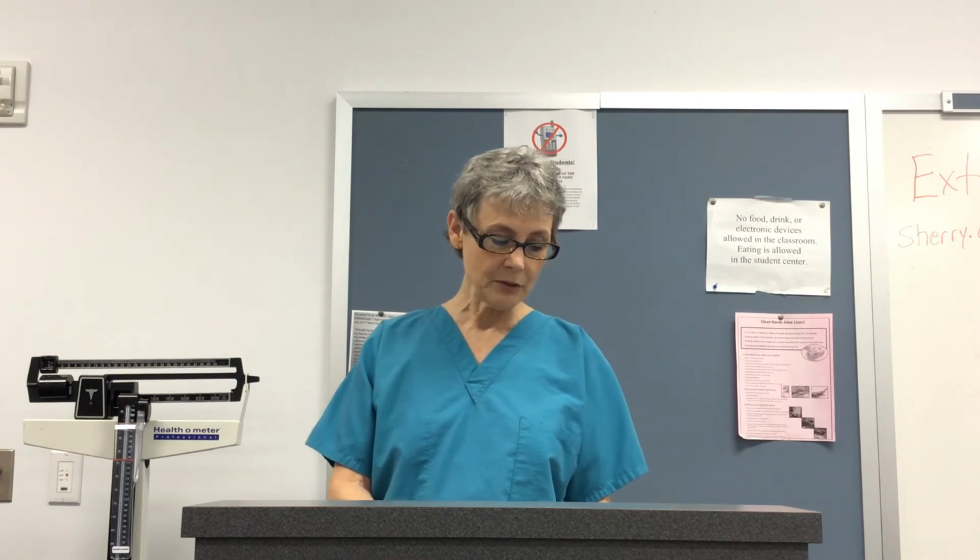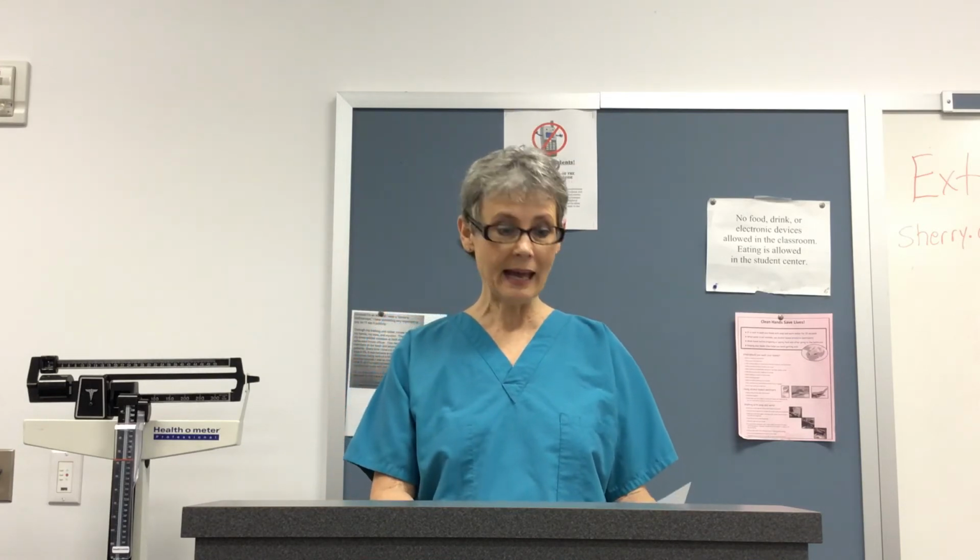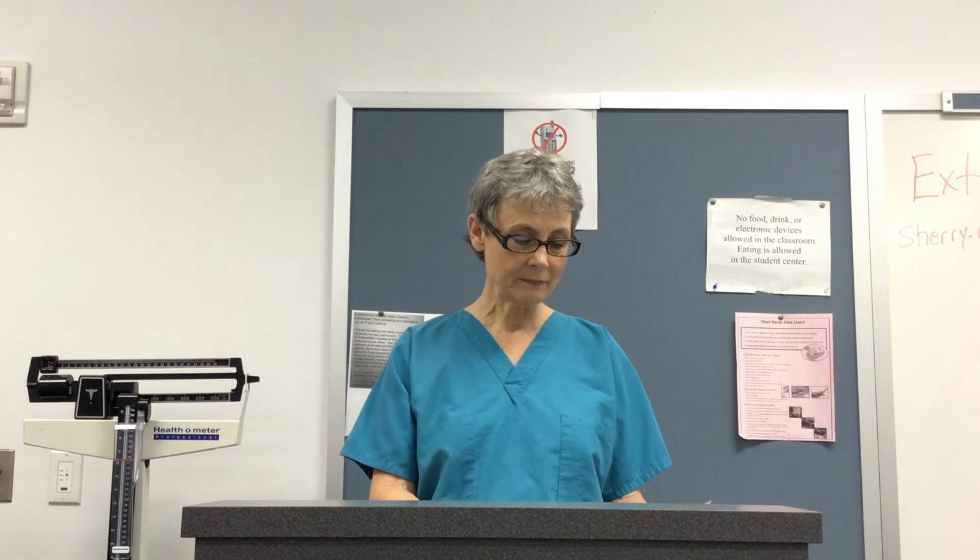In the handout, you'll see a mnemonic, CATSRRR. That's cute, I think. The C is for compatibility, so you want to make sure that the medication you're giving is compatible with the fluid that's running into that IV tubing.